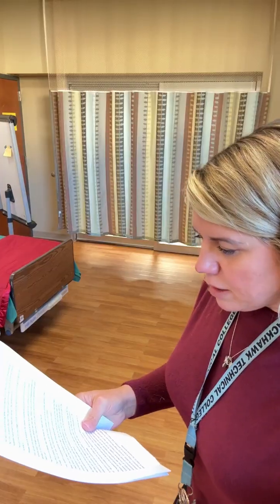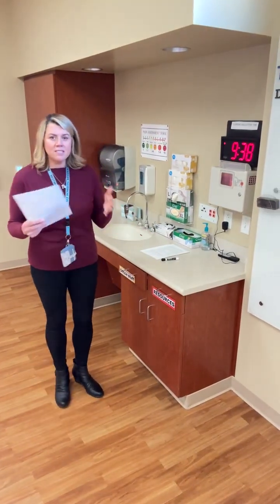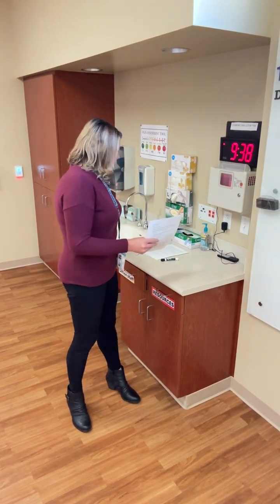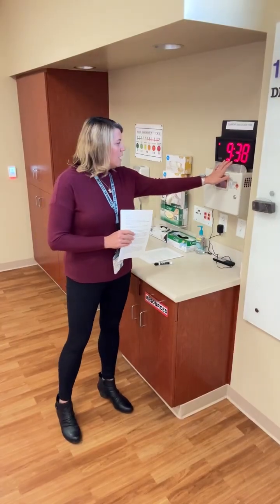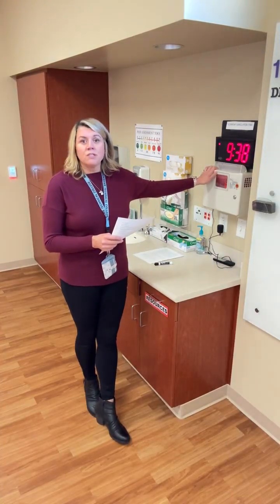We're going to go over here to the sink. This is going to be kind of repetitive if you've already been in sim or if you've already watched one of these or two of these or four of these videos, but we want to make sure that we go over it every single time. You have your sim sink over here. You've got your sim time. This is the time that you should be going by when you're doing any medications. You have your sharps container. All needles will go in here. Please do not put them in the garbage or your pocket, or poke your partner's eyeball out. That'd be great.